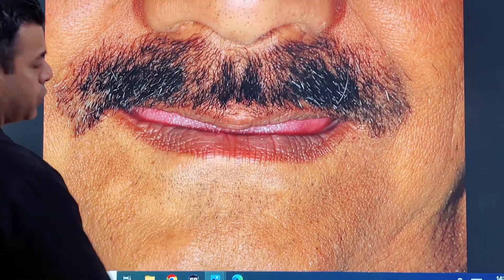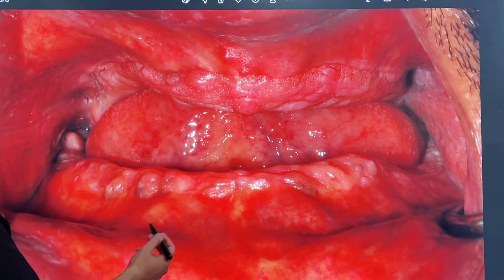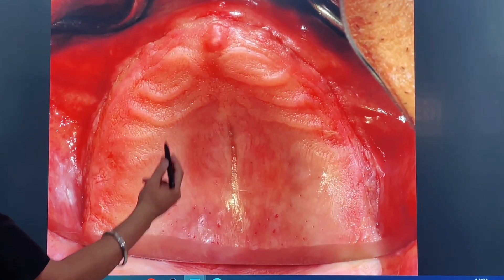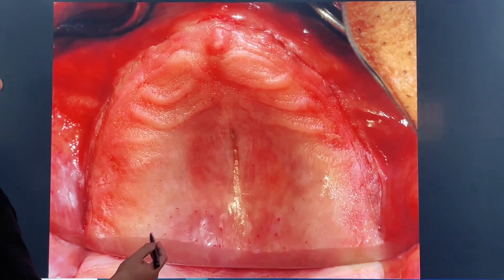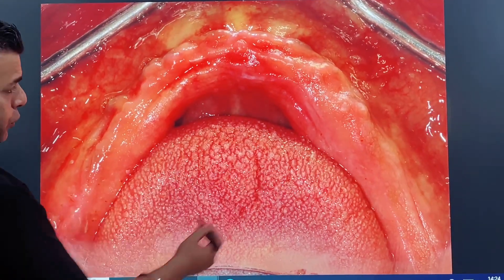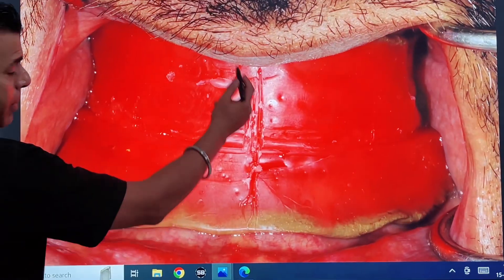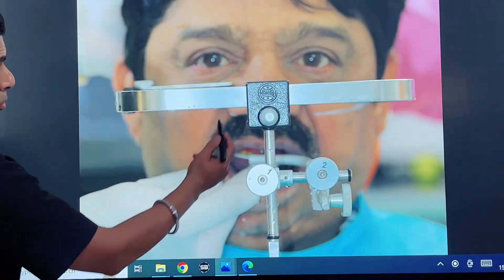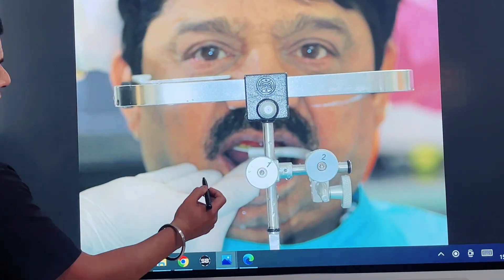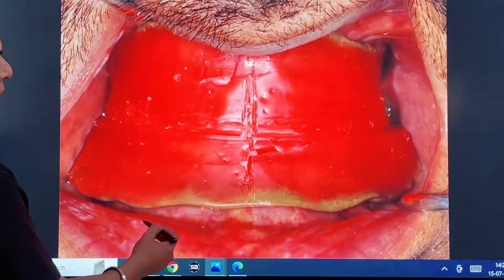After that, we can see this was a pre-op smile. We had a denture ready — you can see the inter-arch space, inter-occlusal space, and papilla. After that, this was the lower. We made rims; face bow is very necessary for any case — you have to know occlusion for any case.